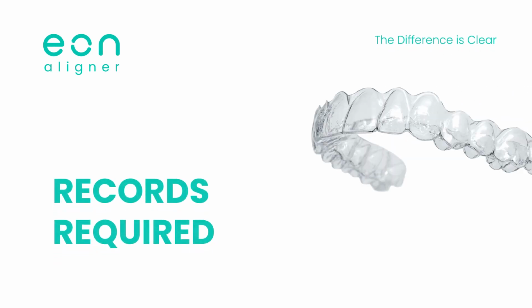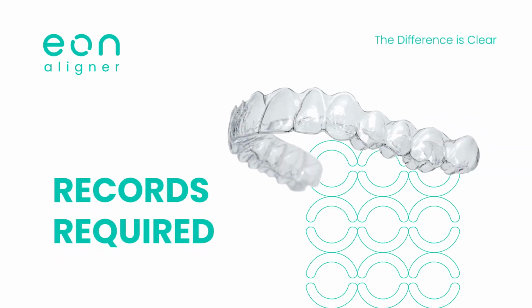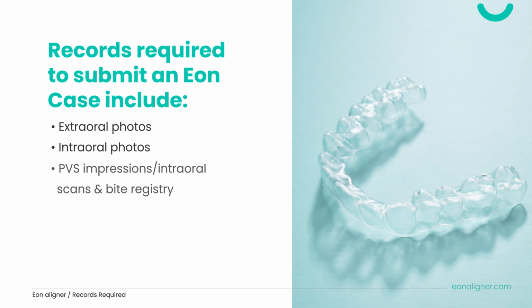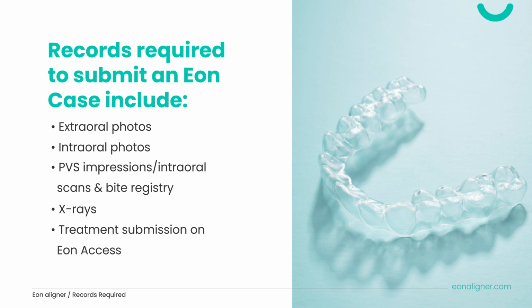In this module, we will discuss the records required to submit an Eon case and set the process of generating a treatment setup in motion. Here's a list of records you will need to submit a case: extraoral photos, intraoral photos, PVS impressions or intraoral scans, and bite registry, X-rays, and then treatment submission on Eon Access.